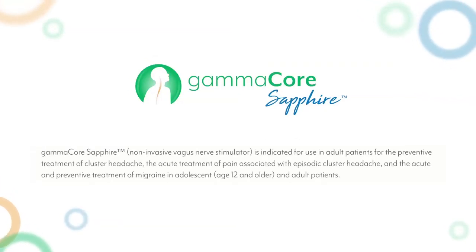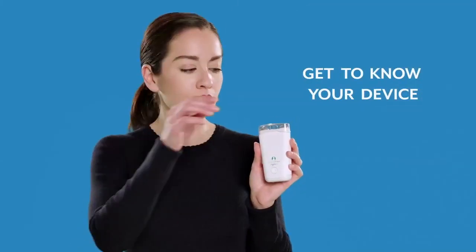This short video will introduce you to your GammaCore Sapphire and show you how to use it. Let's get to know your device.